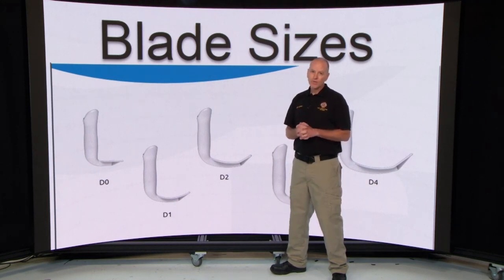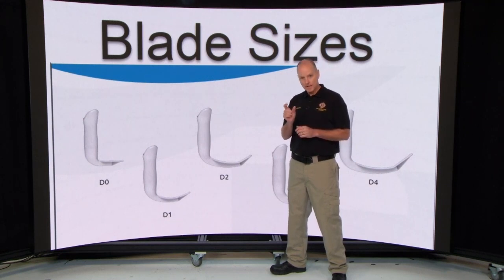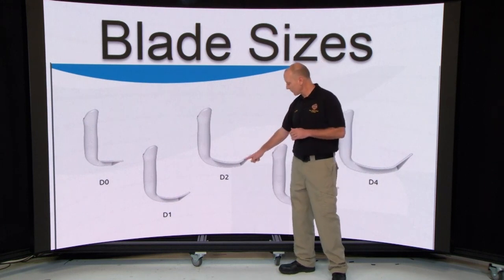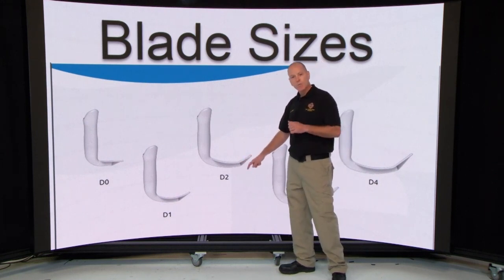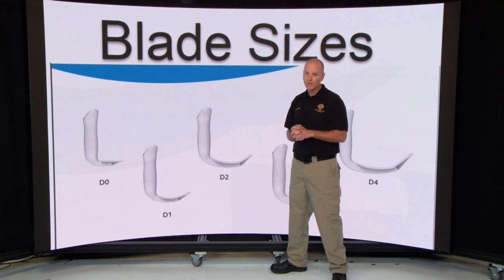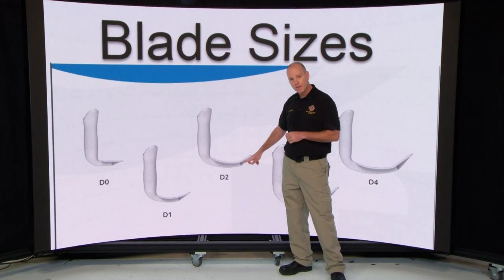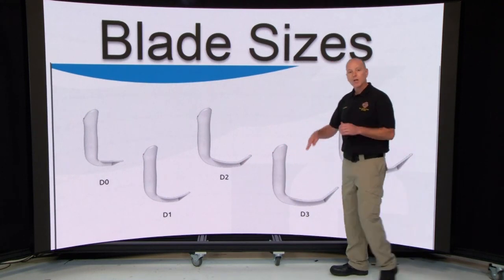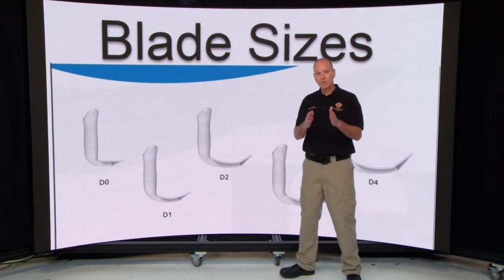We're all used to the McGraths or King Vision, and they have wide blades. So the difference here, for those newer school medics, is that you're going to have to go and do the old school manual intubation techniques to successfully intubate with this device. The cool feature is that every blade is hyperangulated, which means that you can use this like a Miller blade or a Macintosh blade. If you're thinking about it from our McGrath standpoint, it's a combination of the extreme blade, which means that once you choose whichever blade you want for your patient, you only need that one blade to intubate that patient.